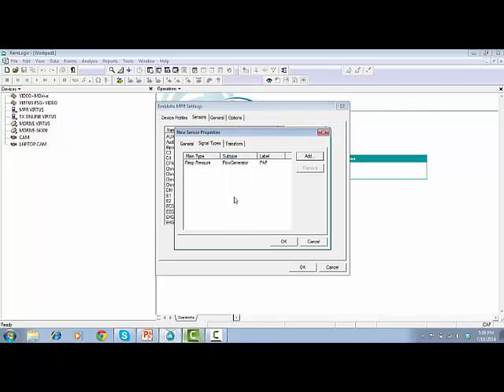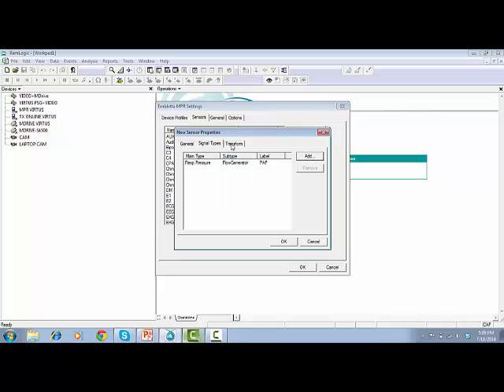On the tab Transform, you might need to enter technical specifications from the sensor manual. In this case, choose Linear Interpolation Type. Change Unit to Centimeter H2O.